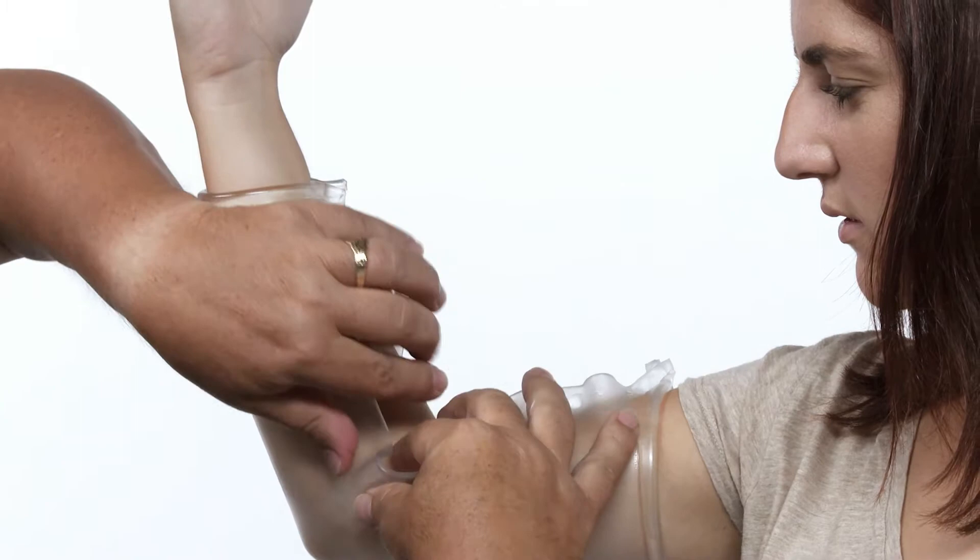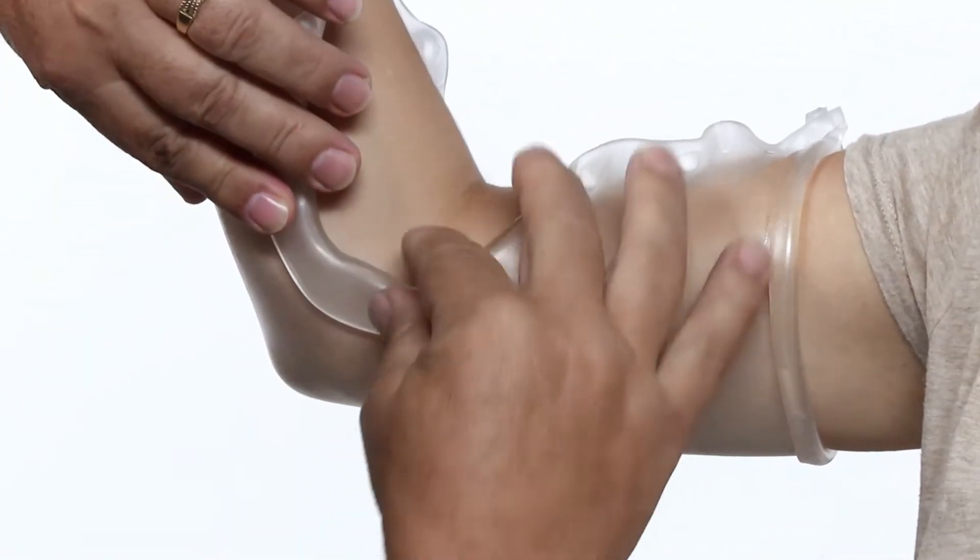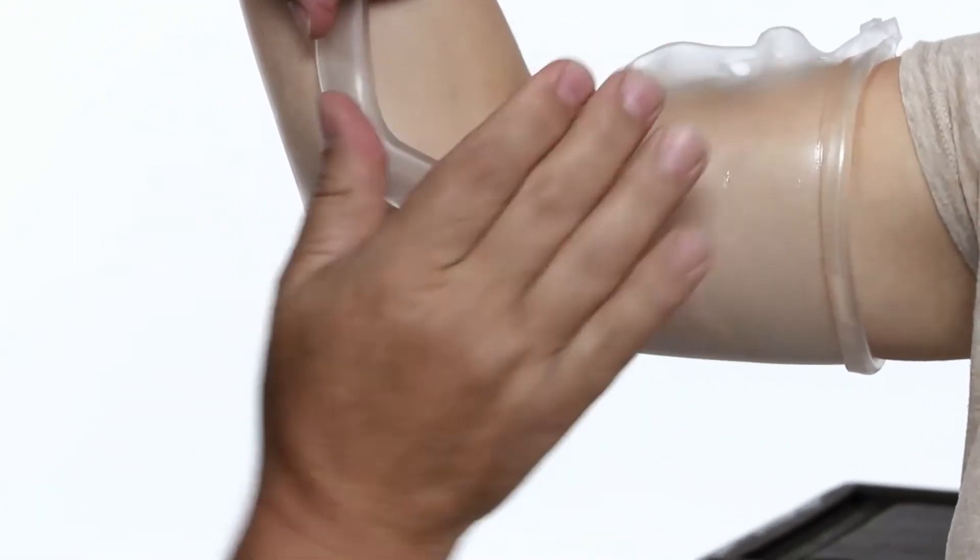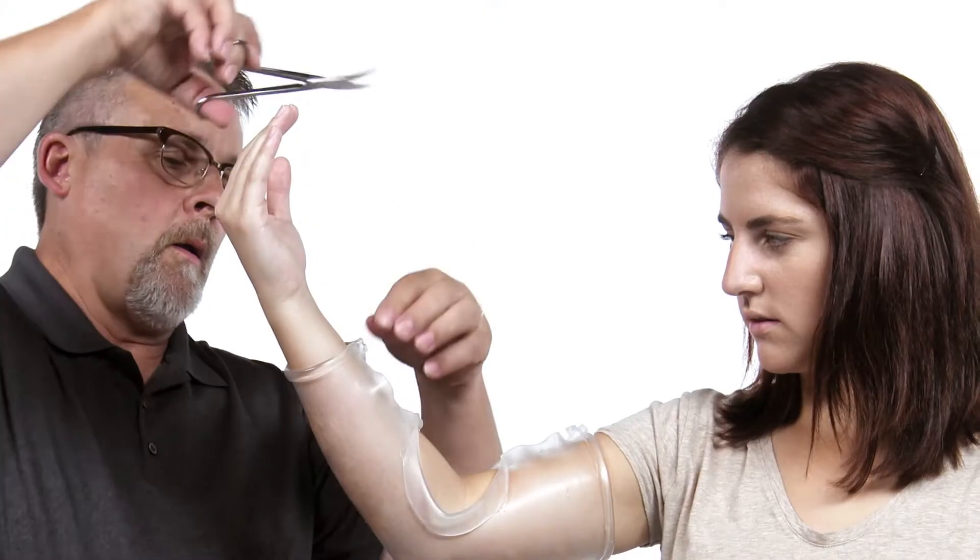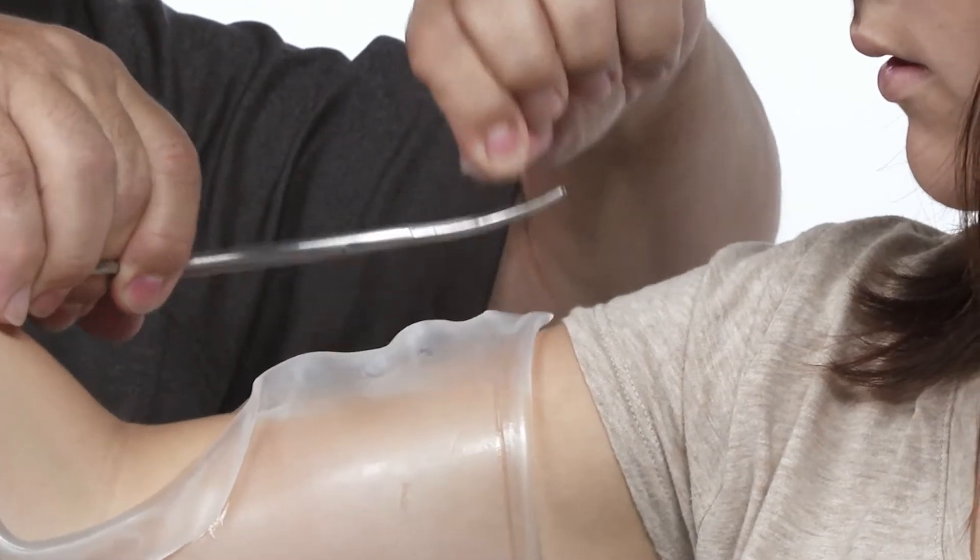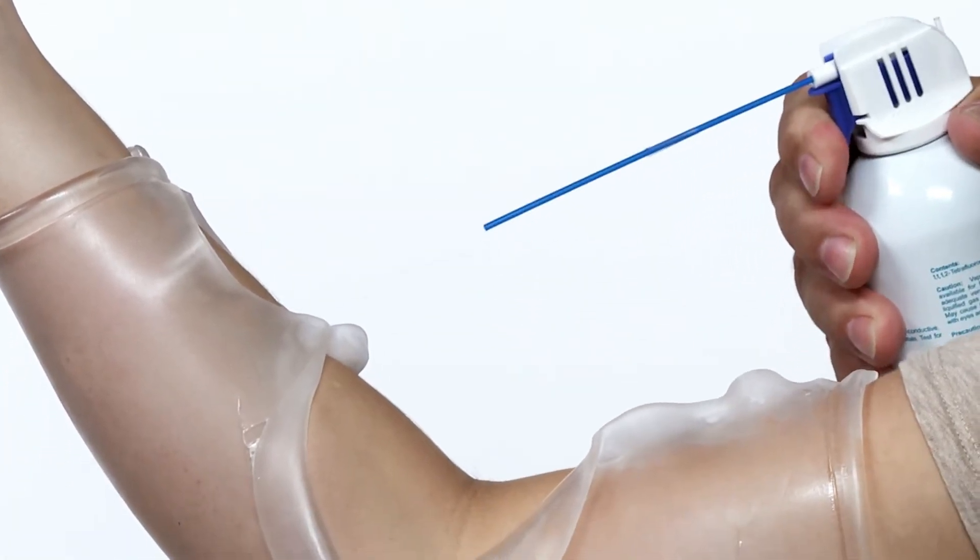Excess material at the elbow can be folded back on itself on both sides of the splint. This folding technique reinforces the rigidity of the orthotic and provides a finished edge. Excessive splint material can be removed while it is still warm. Use cold spray to cool off the lateral borders that are pinched together.